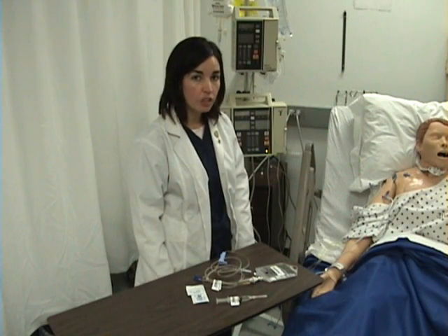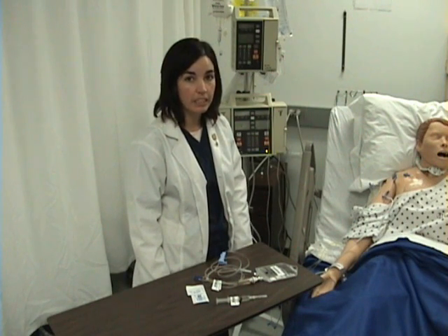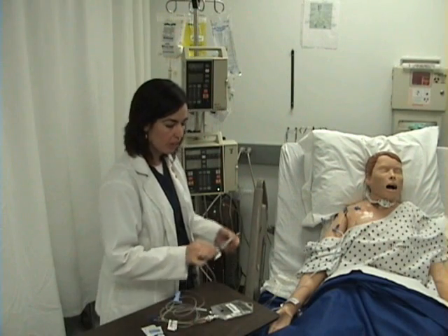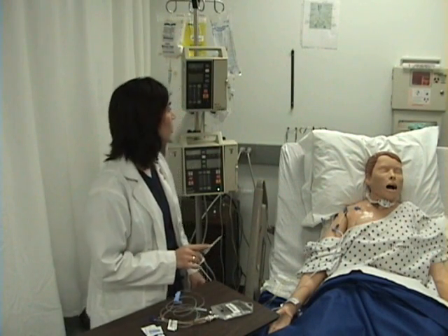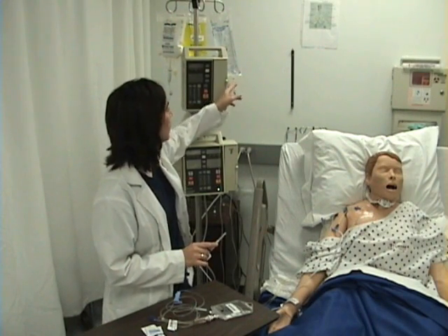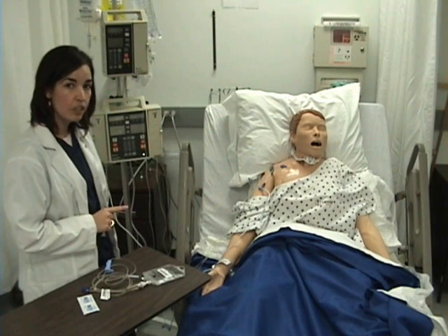I have looked in the drug book and verified that both medications are compatible with normal saline. I will begin with the IV Push Reglan. The first thing I want to do is stop the pump that has the normal saline running through it. The other two lines can continue running.